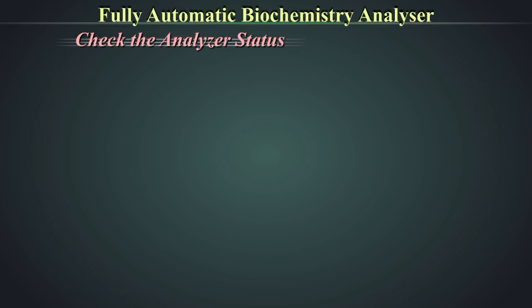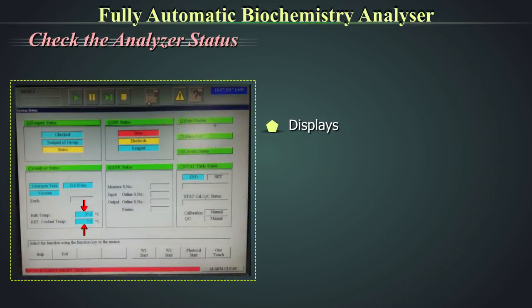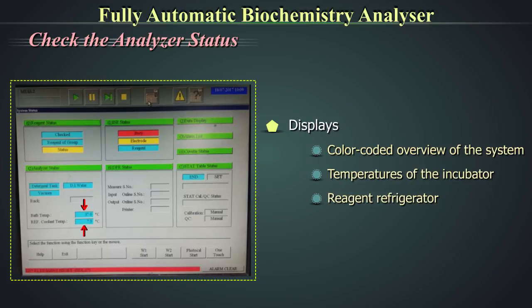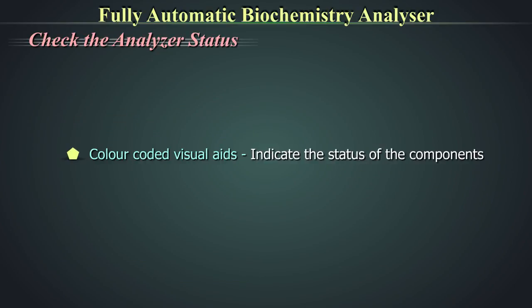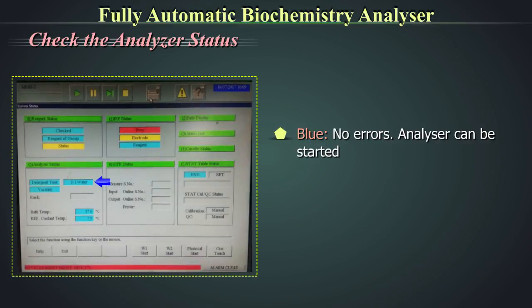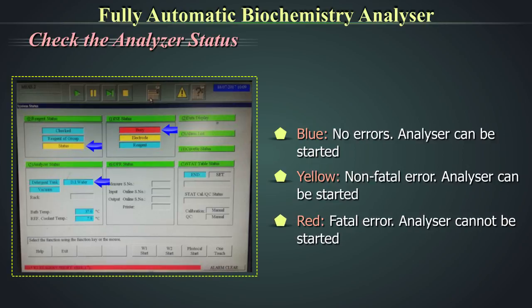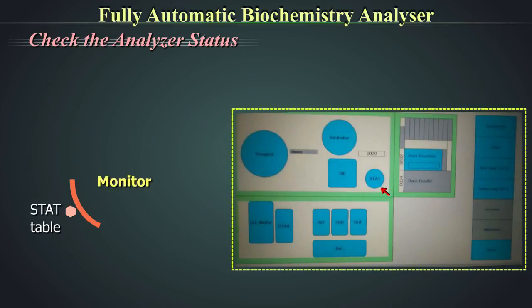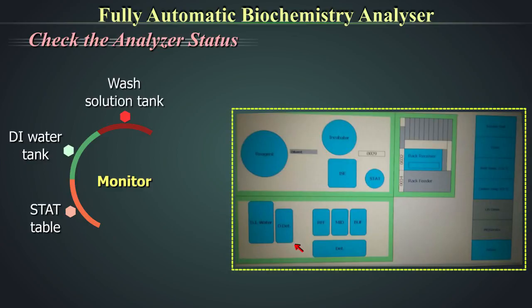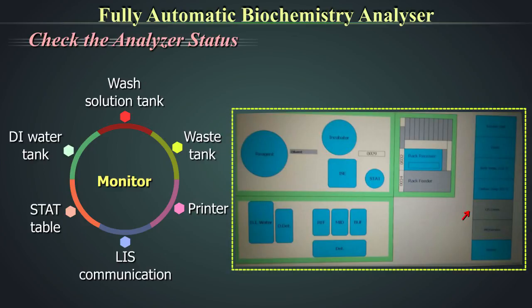The analyzer status menu displays a color-coded overview of the system and the temperatures of the incubator and reagent refrigerator. For example: blue means no errors and the analyzer can be started; yellow means a non-fatal error and the analyzer can be started; red means a fatal error and the analyzer cannot be started. The stat table, deionized water tank, wash solution tank, waste tank, printer, and LIS communication are also monitored similarly.